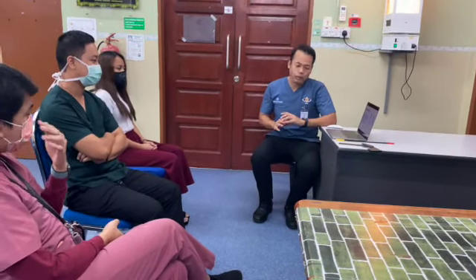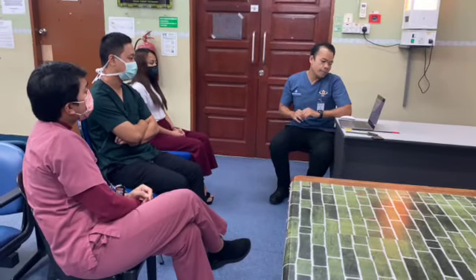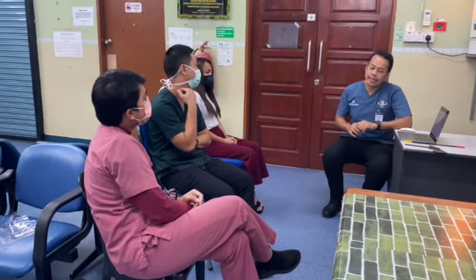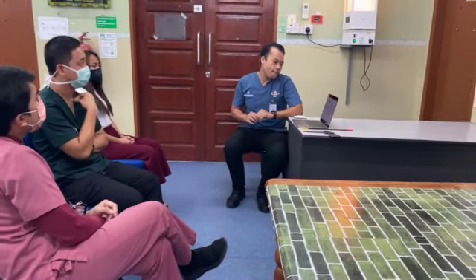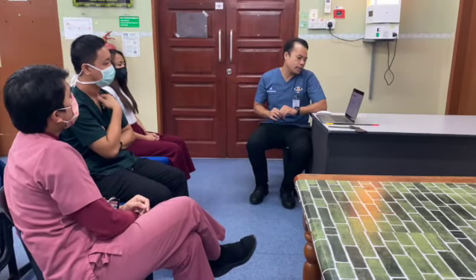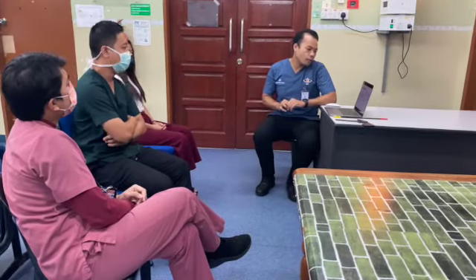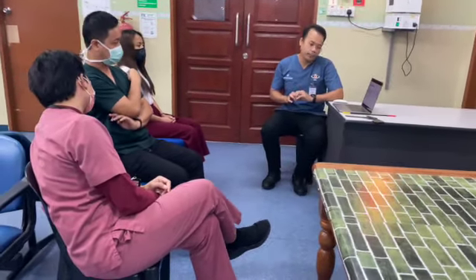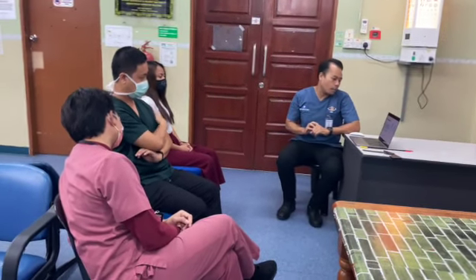What is a visual acuity test? Visual acuity is measured by chart, optical instrument, or computerized test. Eye charts are the most common method of visual acuity testing. They show several rows of optotypes, for example numbers, letters, or symbols, that get progressively smaller toward the bottom.